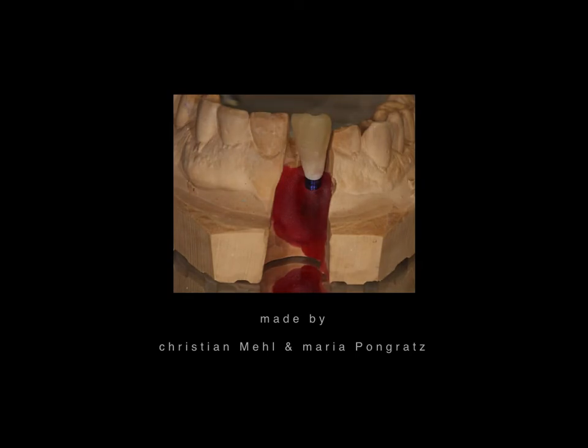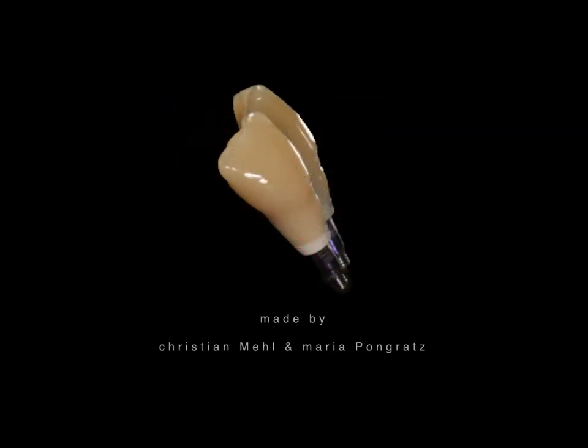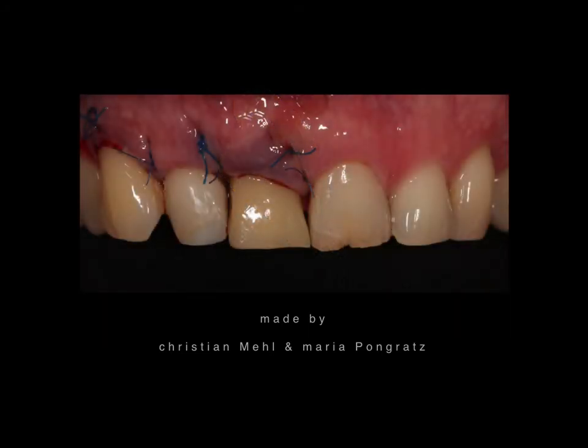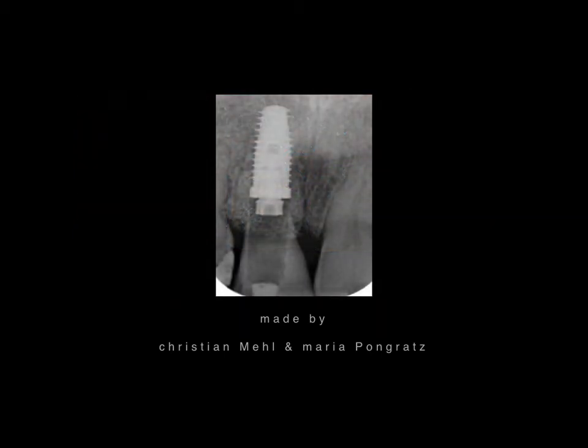Of course, we will do everything not to cement the temporary, in order to avoid any cement rests, and screw retain it on the placed implant. Important is that the implant has a torque of roughly 35 Newton centimeters, the minimum. Then place the temporary into the situation, temporary filling on tooth 1, 2 as well, and seal it with sterile Teflon bands, and Tetric Flow filling buccally.